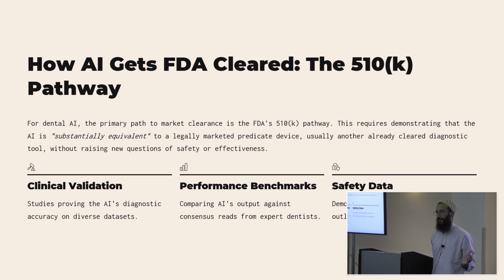I know that a lot of that capability has grown since. The product will say, this is caries, this is whatever. I don't know enough about non-tooth-based lesions, but if it's marketed as something we can detect, that means it's cleared by the FDA.